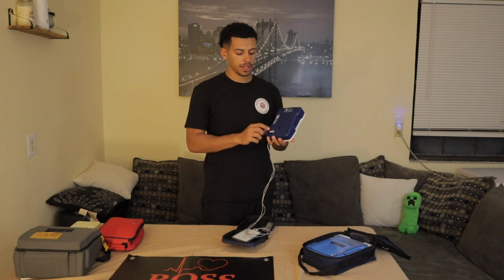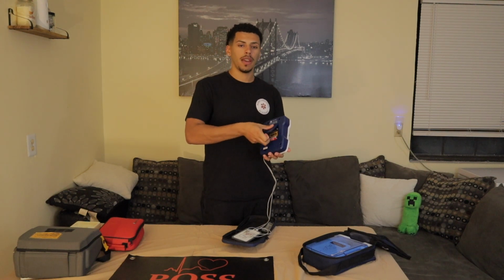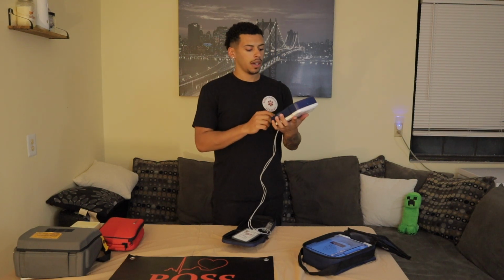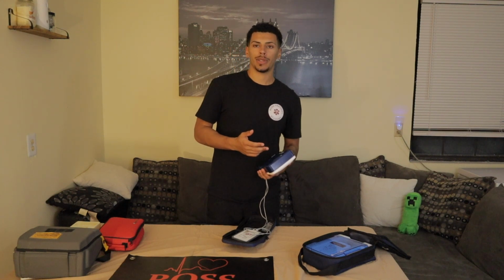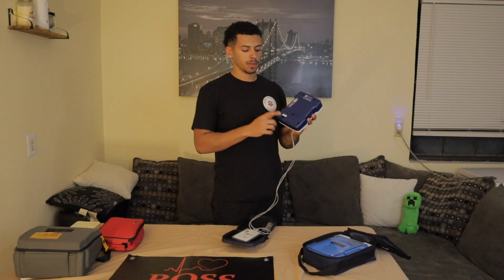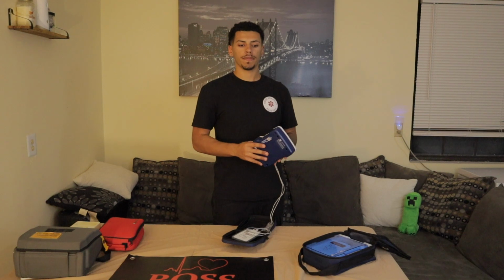So over on the back side, you're going to have your button to change it from English to Spanish. And then you also have your battery compartment, and it's just going to have 3 C batteries. These ones also have a little port down here where you can plug in a software update. Just as new protocols come out for CPR, you can buy a little update module, I believe, and just plug it in there, and then it updates the machine, so you don't have to keep getting new machines every 5 years when there's a CPR update.